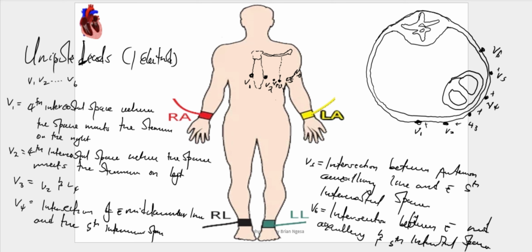So we say the positive is a representation of the eye. So it is likely to tell us information, mostly as it relates to the ventricle. So this is the right ventricle and the left ventricle. So this is how we expect the ECG leads to be placed, specifically the electrodes, the specific anatomical areas on the body surface where we anticipate them to be placed.